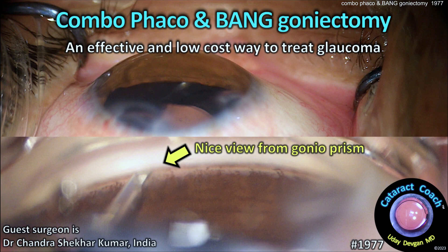CataractCoach.com — Combo phaco and BANG goniectomy: an effective and low-cost way to treat glaucoma and fix the cataract.